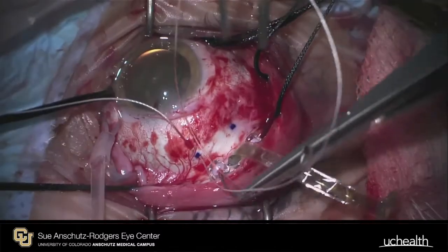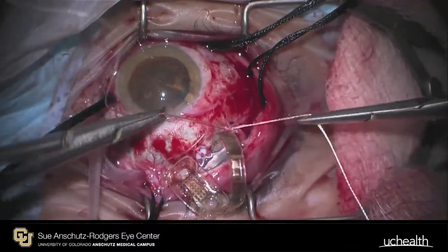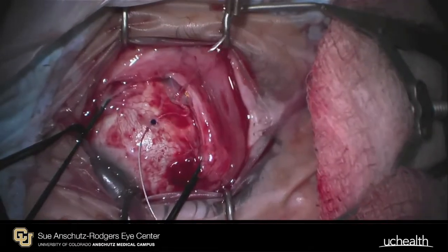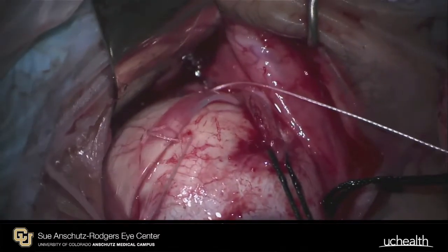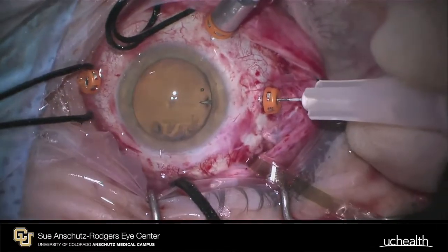Critically important is placement of the suture tabs. The distance from limbus to suture tab placement is based upon the axial length of the eye. Another anchoring suture is placed inferotemporally to anchor the antenna. Mattress sutures are placed in a standard fashion in the other quadrants to secure the band to the globe.